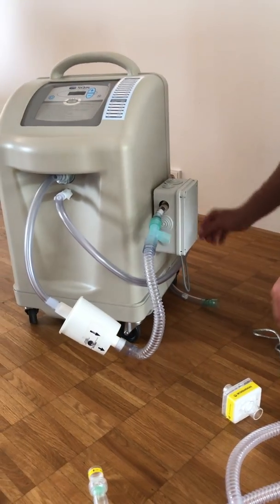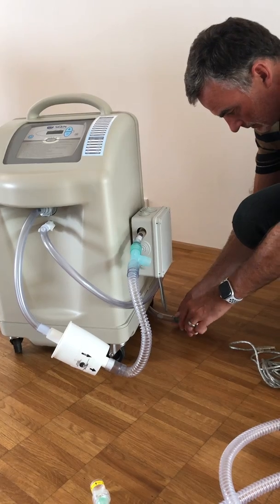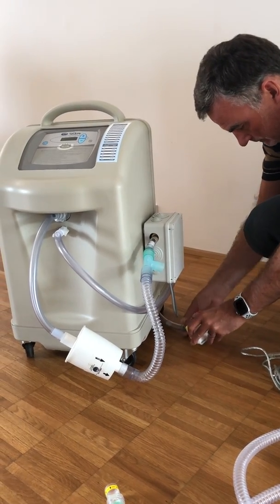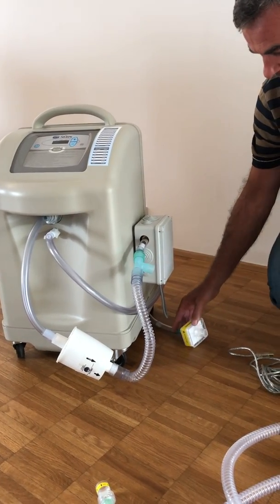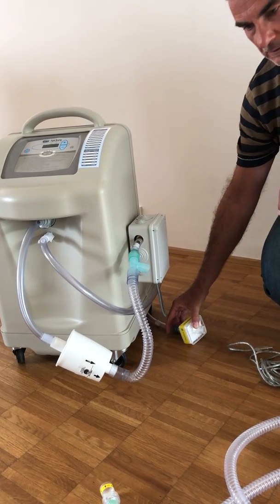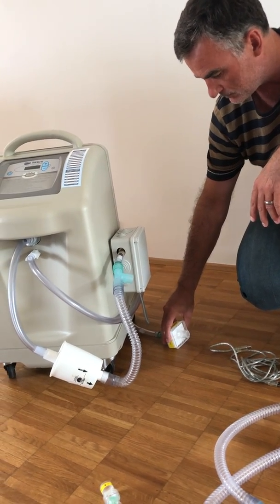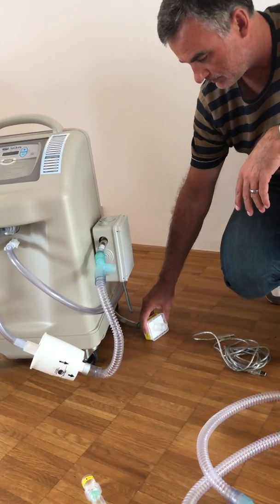If you have this, you can place this small filter to the outlet of the generator. This is needed because we have a lot of air coming out in the hyperoxic phase, and to minimize the noise we have to connect this filter.